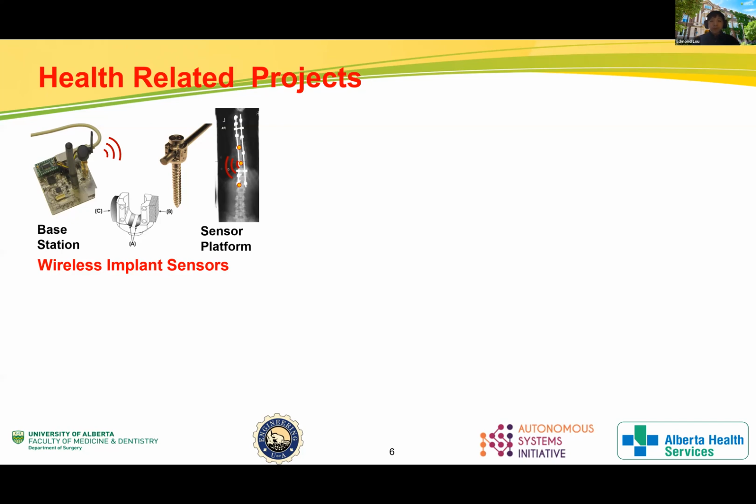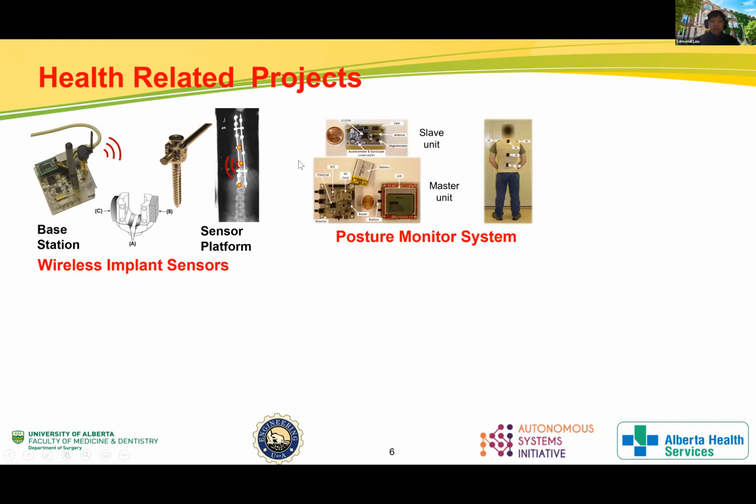The next project that I would like to talk about is the posture monitor system. It was initiated from the Edmonton Scoliosis Clinic 10 years ago, and of course we've been upgrading and making changes.